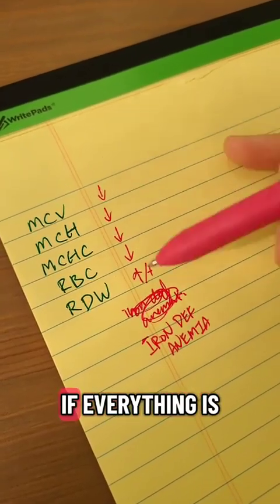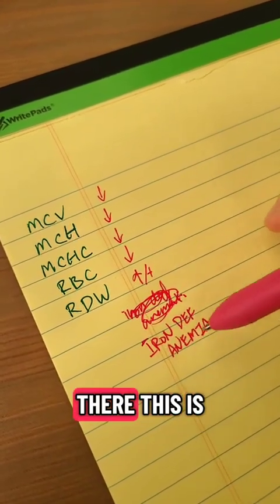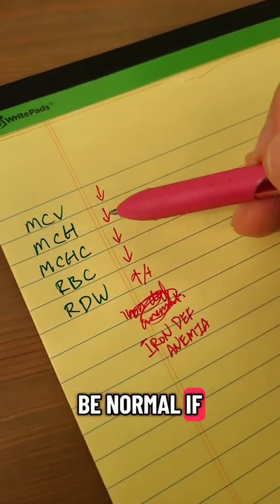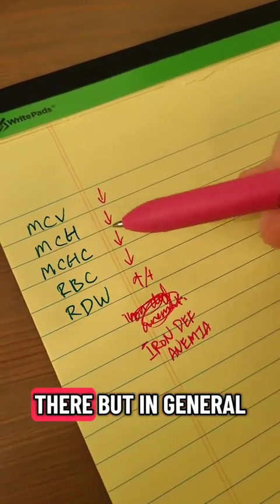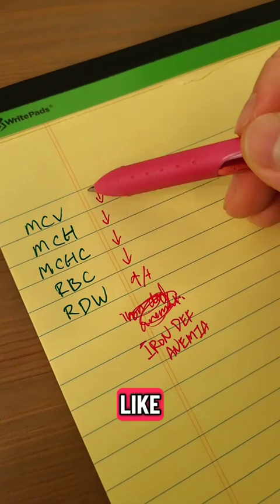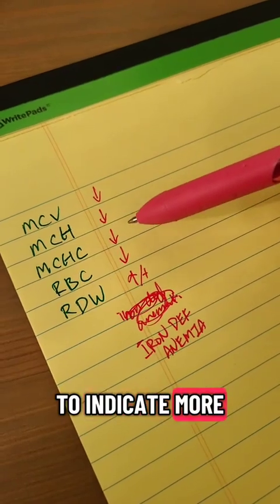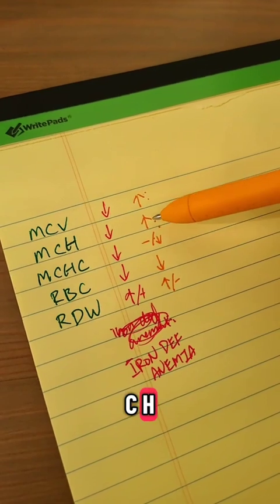Yeah, so if everything is low or borderline low and the RDW is getting up there, this is iron deficiency anemia. Your red blood cells might still be normal if you're approaching iron deficiency anemia, but not quite there. But in general, a picture of everything being low, especially these three things, is going to indicate more iron deficiency.